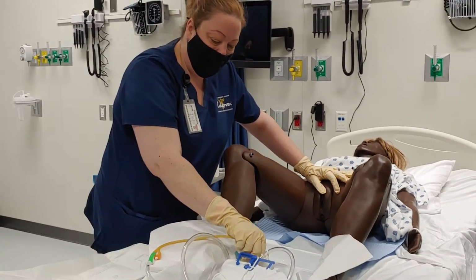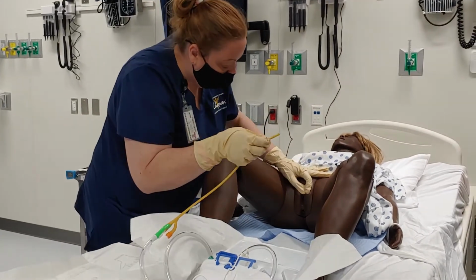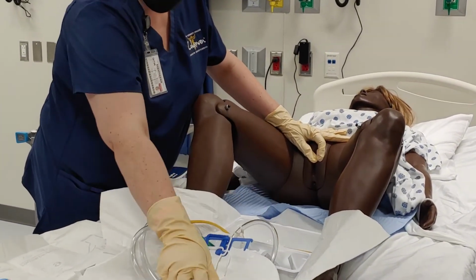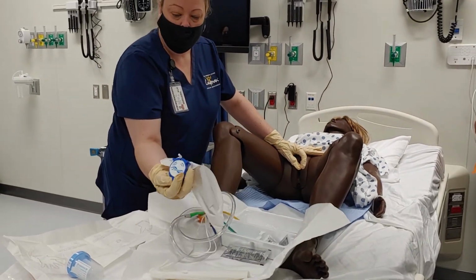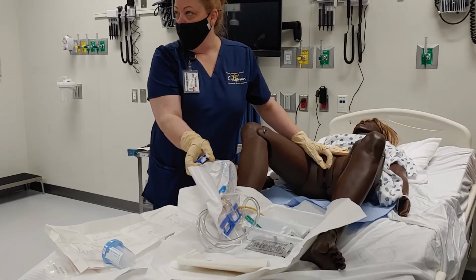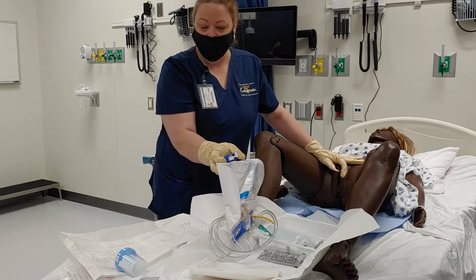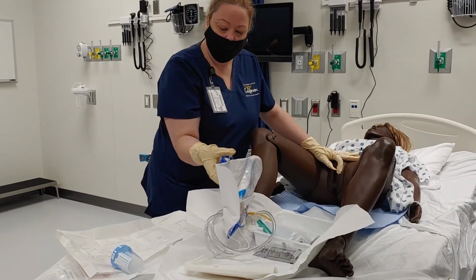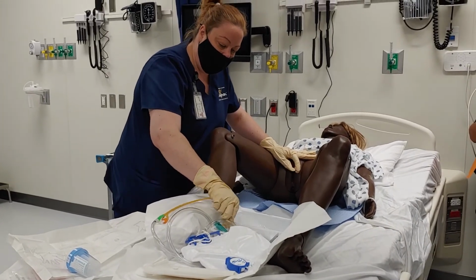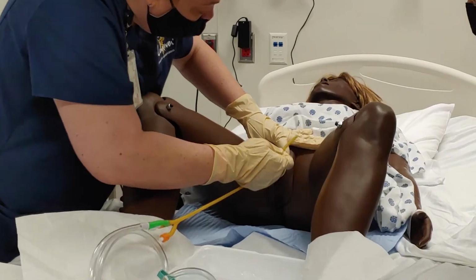Again, I'm going to put it and get lots and lots of that lubricant on it. Once I have that lubricant there, first I'm going to make sure this is closed. So you have an open and a close on here. You want to make sure this is closed. Because if you don't, as soon as you put that inside the bladder, you're going to have a mess all over the bed. All right? So make sure that this is closed, and that is. Now I'm going to pick that up. Again, get it all lubricated up. I'm going to try to hold this open.